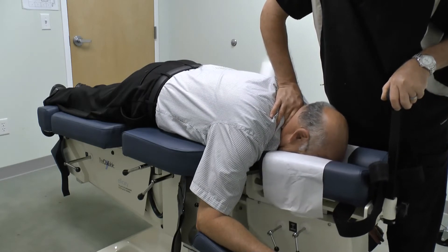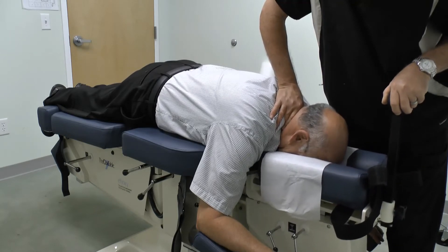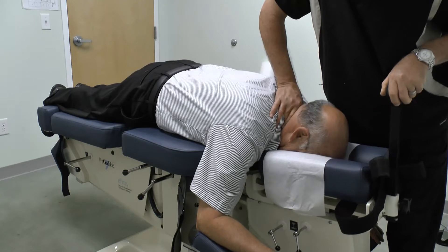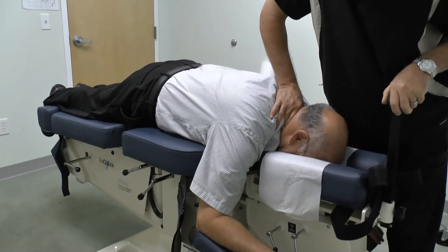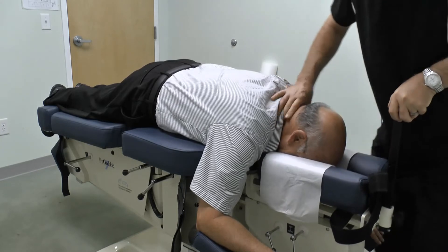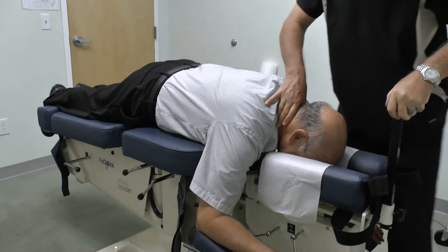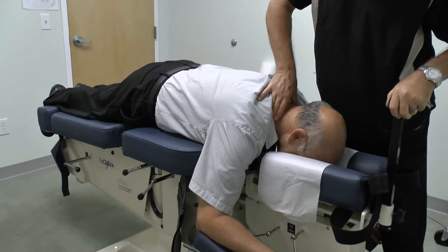Gentle extension, and following the extension we'll finish up with rotation under long y-axis distraction.